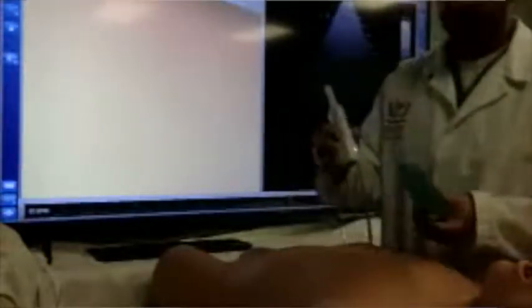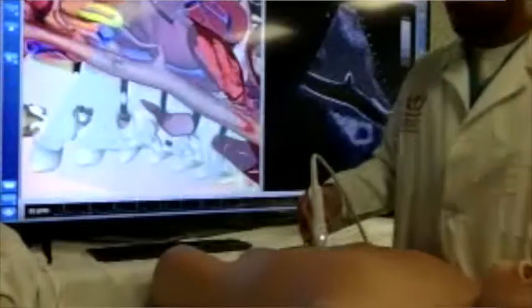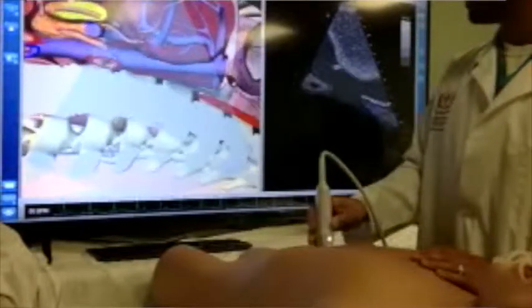Important again, every time we see the indicator, imagine this is your ultrasound plane coming out along that path of the indicator here. So this is that ultrasound plane coming in and crossing the section. So now we place it initially at the subxiphoid space, indicating aim at the 12 o'clock position.